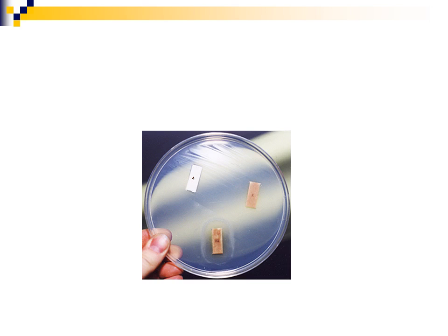We talked about the X and the V factors, or hemin and NAD, and how various species require either the X or the V, or X and V. Haemophilus influenzae requires both X and V, so they have X and V discs. Usually you buy them in a disc.